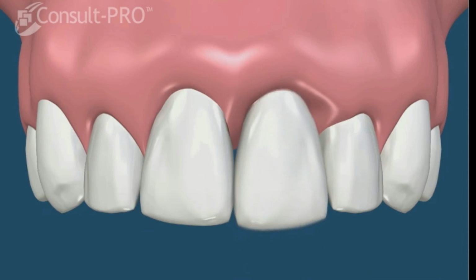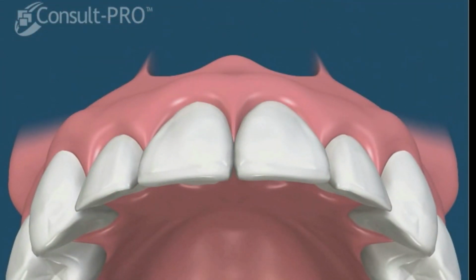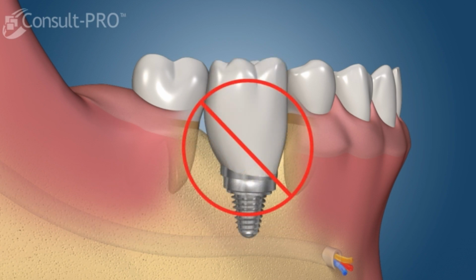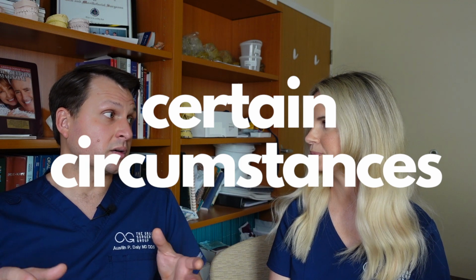It may sound like an investment in your time, but it is so worth it. You don't want to skip any of these super necessary steps in the process. You don't want to put the tooth in before there's adequate bone in that area, or else you may lose the tooth and lose the money that you put in. So yeah, it's important.